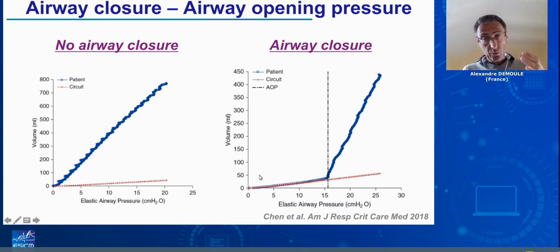On the right, when there is airway closure, we have a totally different pattern. As you can see, at the beginning of inflation, the pressure increases, but the volume does not increase. And then after a certain level of pressure inside the airways, the volume starts to increase. And this pressure above which the volume starts increasing is the airway opening pressure.